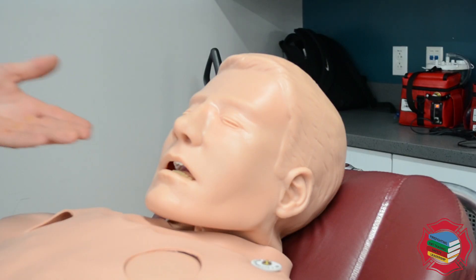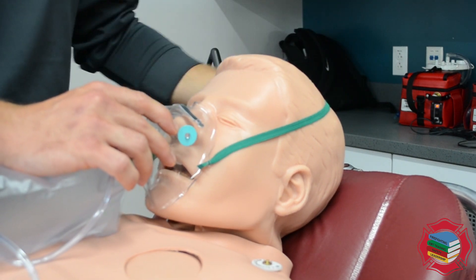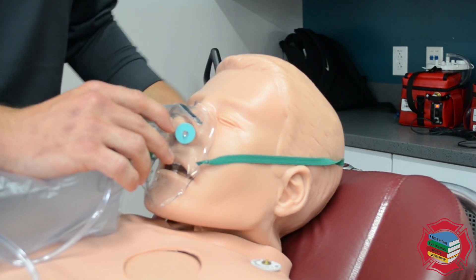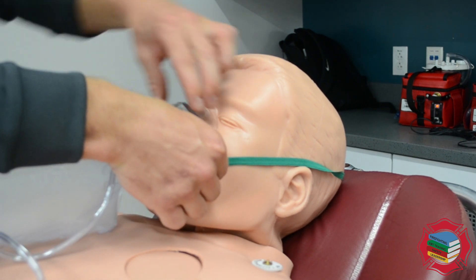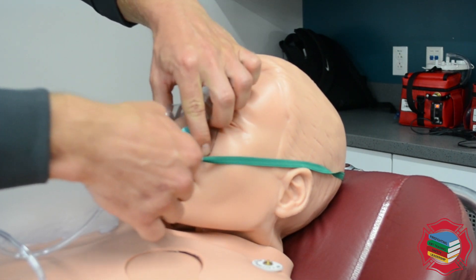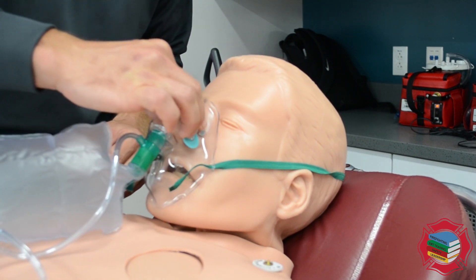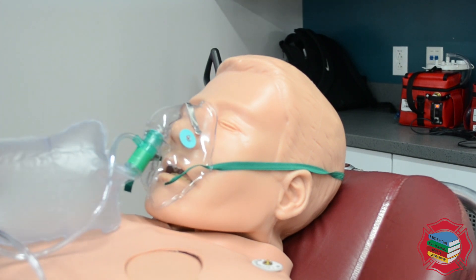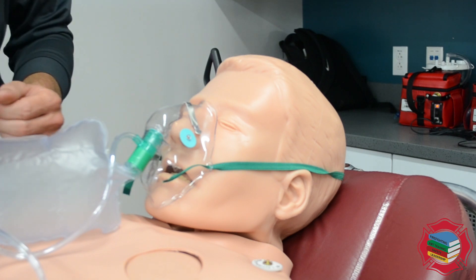To apply the non-rebreather mask to a patient, simply instruct them to breathe normally while you stretch the elastic band out in one hand and apply the mask to the face with the other hand, looping it around their head. Be careful not to pull on their hair too much — the strap should go above the ears around the back of the head before you cinch it down. Then this nose piece should be firmly affixed to the patient's face to get a nice face-to-mask seal, ensuring they get the highest concentration of O2 possible.